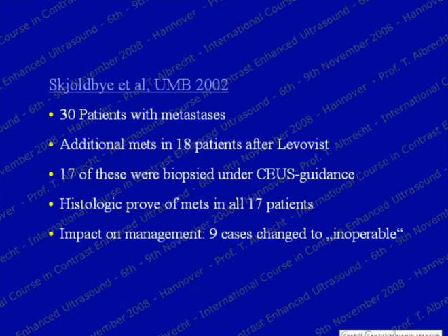I think this is what this study proves, and furthermore, in about a third of the cases, these patients were changed to inoperable, unresectable, based on the result of the contrast-enhanced ultrasound combined with biopsy. I think this is really quite important because it means unnecessary operation was spared to about a third of this certainly selected population in this study.